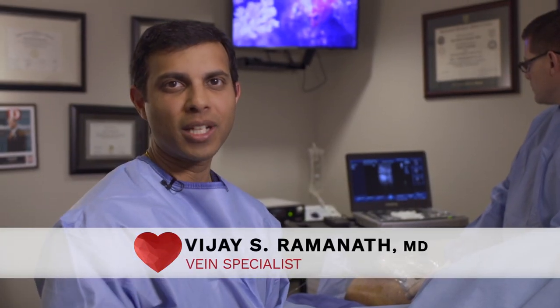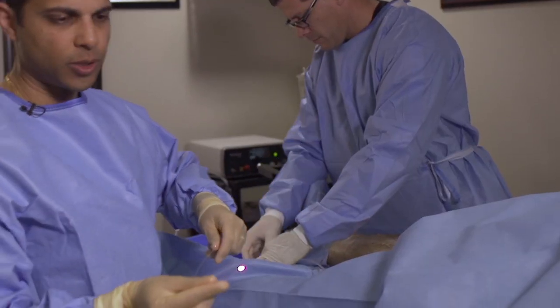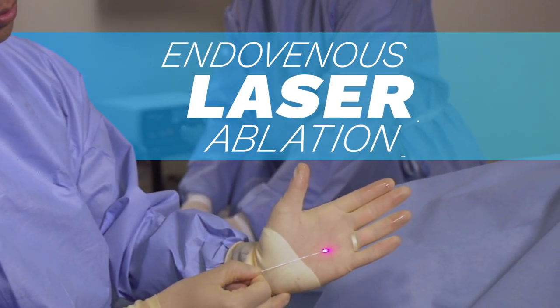Welcome to Texas Vein Health. I'm Dr. Ramanath. Today we're going to be doing an endovenous laser ablation, specifically meant for patients with symptomatic varicose veins.